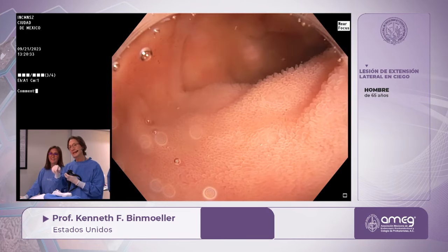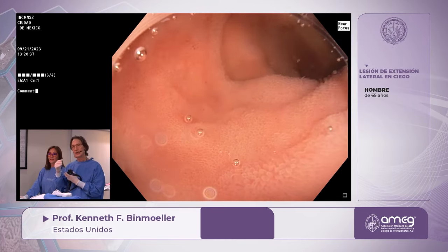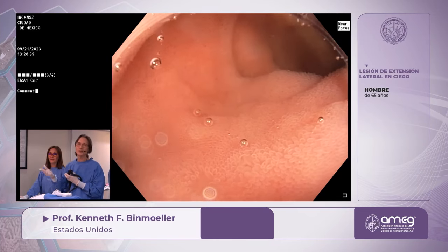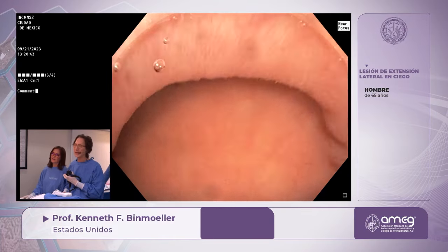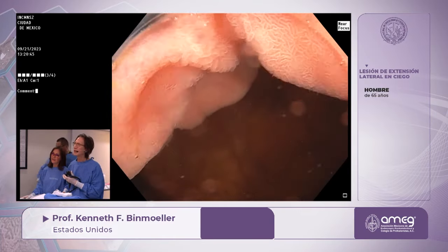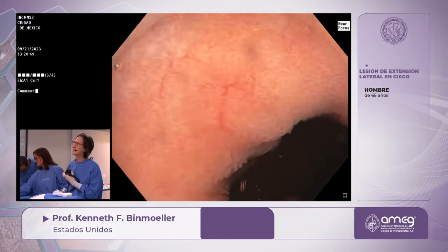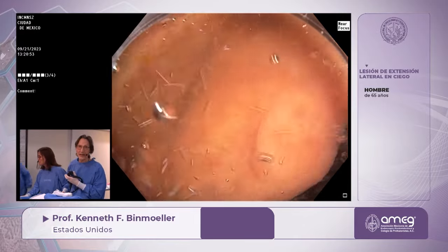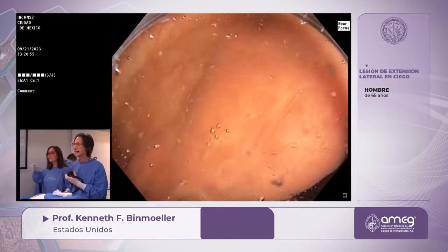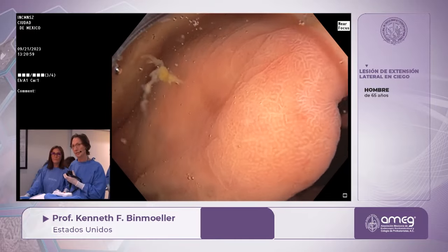As you know from pill endoscopy, from the pill cam, you get these beautiful views because it's underwater. And because the small bowel and colon is normally filled with water. So here you can see very nicely the IC valve. And this is why we can also resect lesions on the IC valve, like the one you saw earlier today that Maria showed you. But you could have done that one also underwater.